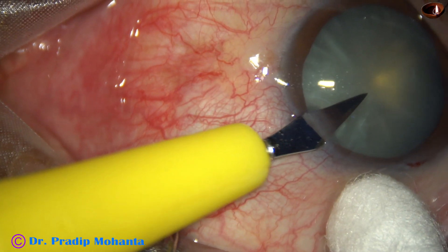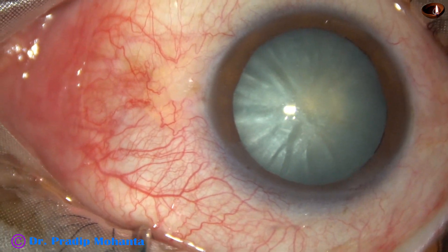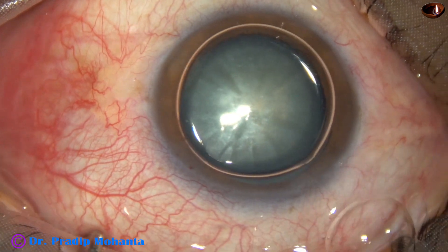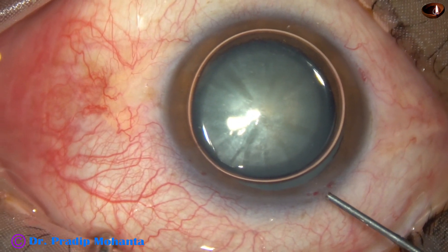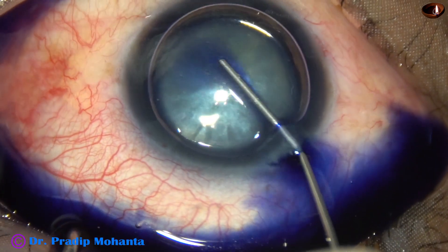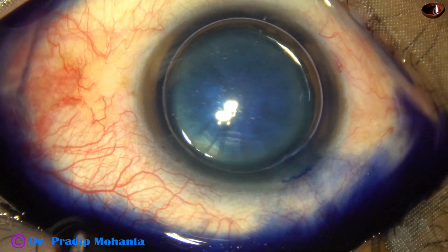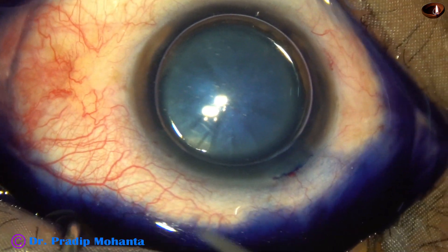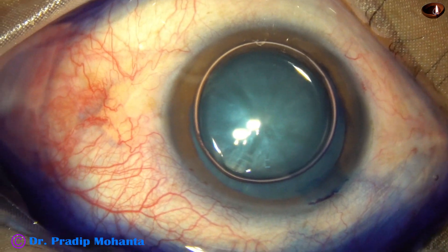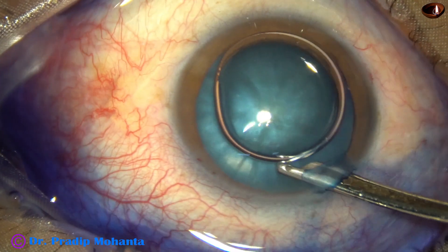After making the incisions, an air bubble is injected into the anterior chamber. Trypan blue dye is applied underneath this air bubble. When we apply dye underneath an air bubble and the dye touches all parts of the anterior capsule, the staining is very fast and very good. This is a real-time surgery, and you will see how quickly the dye has stained the anterior capsule.